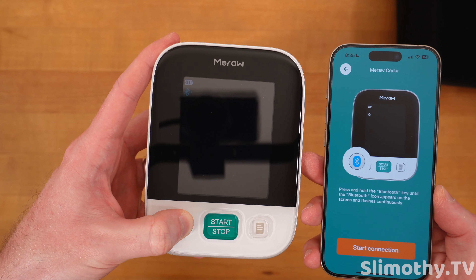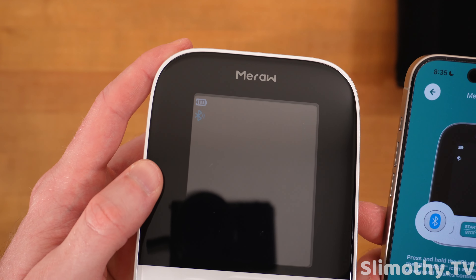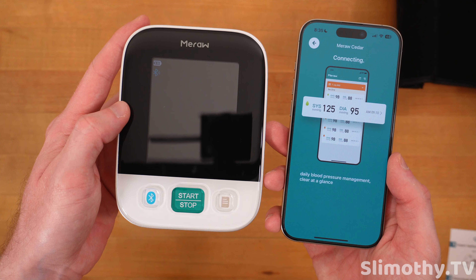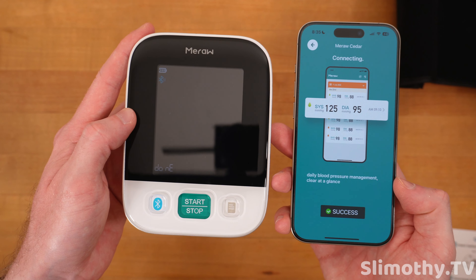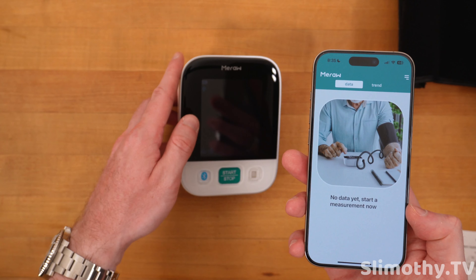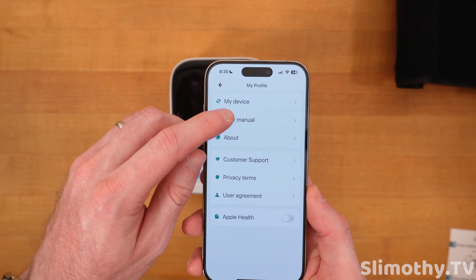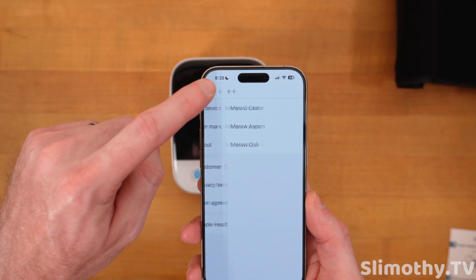Pressing and holding — it is flashing up at the top, hard to see with these studio lights, but there it is. Start connection — success! That's what we want to see. We are all paired up. That was super easy.